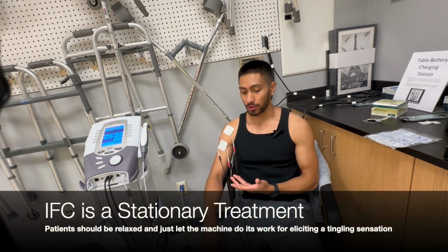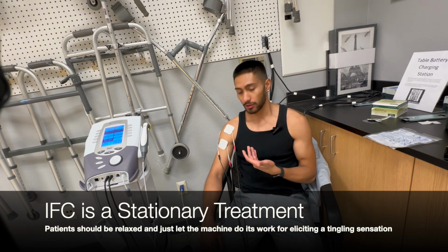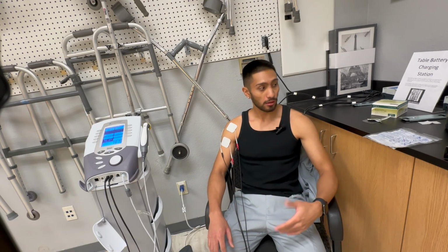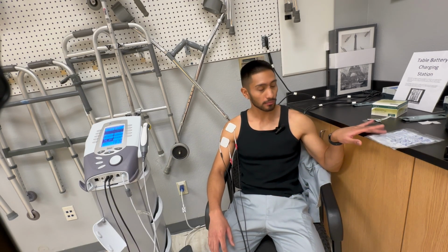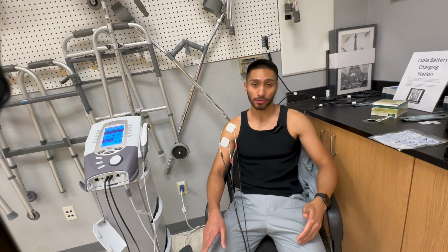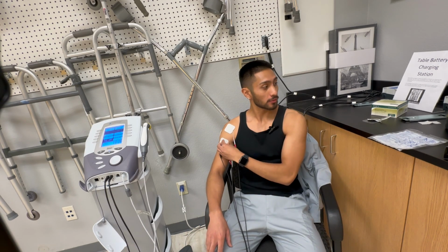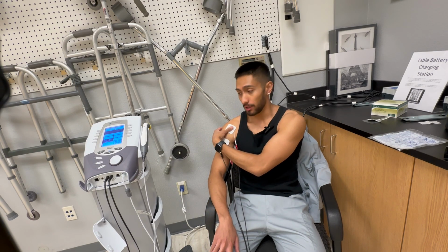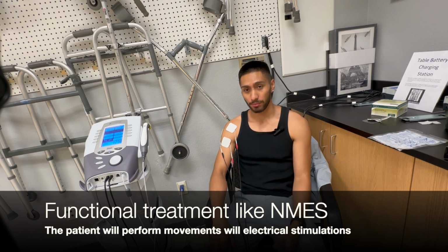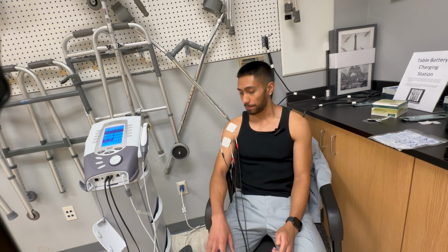Now, this is a stationary treatment, and that means it's not functional. The patient can just relax, sit in a chair, and wait for the treatment to go on. We give them a bell, just in case they need to signal the physical therapist assistant or one of the staff to get their attention if we step away. Right now, we're just going to be stationary, not have to do any functional movements, unlike other treatments like NMES and Russian treatment for electrical stimulation.